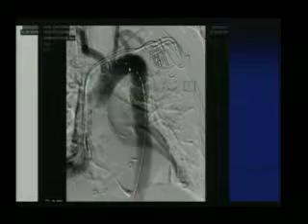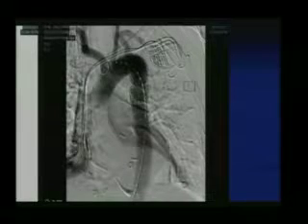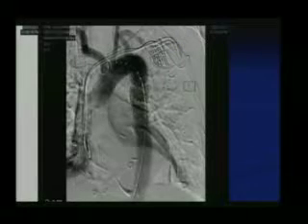Medtronic has the Aptus screws, so you screw the stent graft into the aortic wall to close the type 1 endoleak. You can coil the proximal side with coils if you can. So these are the measures you can use to fix it: the cuff, the endo anchors, or coils. The same with type 1B.